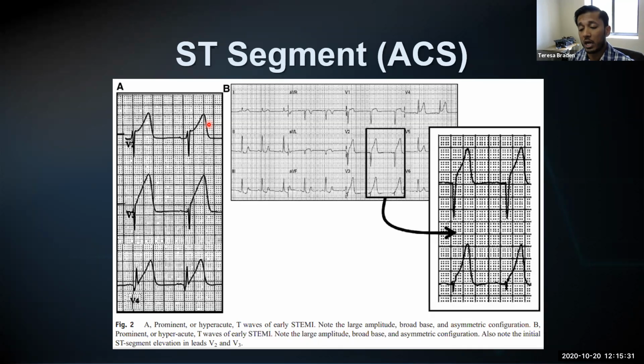If you recall the talk from Dr. Seeker on hyperkalemia that he gave just a few weeks ago, he mentioned that one of the providers came and talked to him thinking this is ACS. He said, no, this is hyperkalemia. Just give them some medications to try and lower it, and it seemed to help. But I think it was the right concern in general, to make sure that they're not missing that, right? I brought these in here because these ST segments can have all kinds of appearances, even Brugada type appearances, which we'll get to.